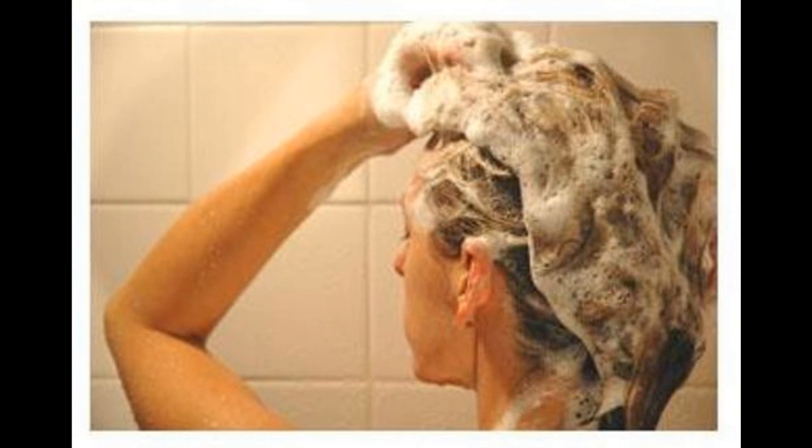Preparation is minimal. Hair should be clean and free of oils, sprays, and conditioner. Any hair extensions, pieces, or weaves must be taken out. This helps the electrodes to stick to the scalp.